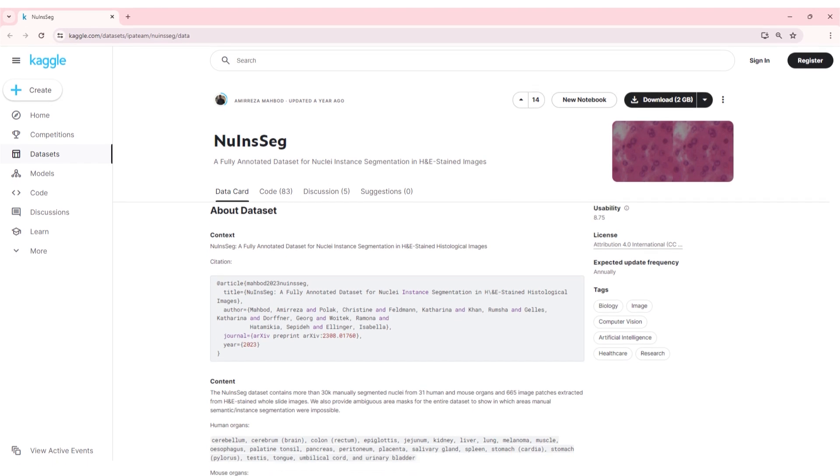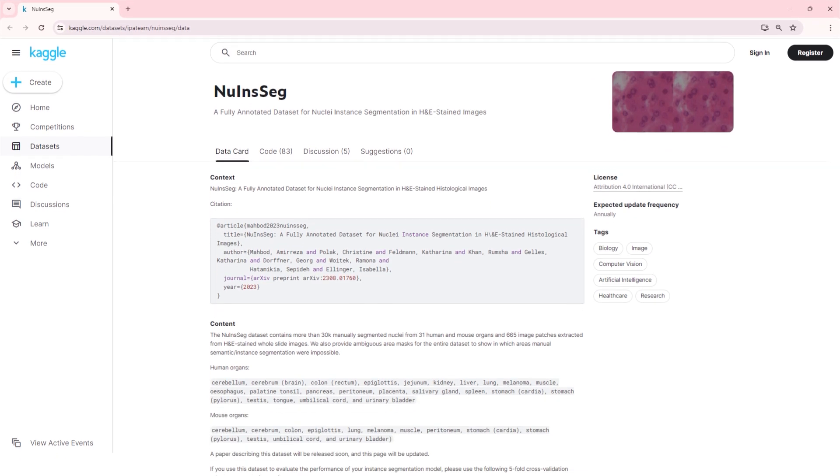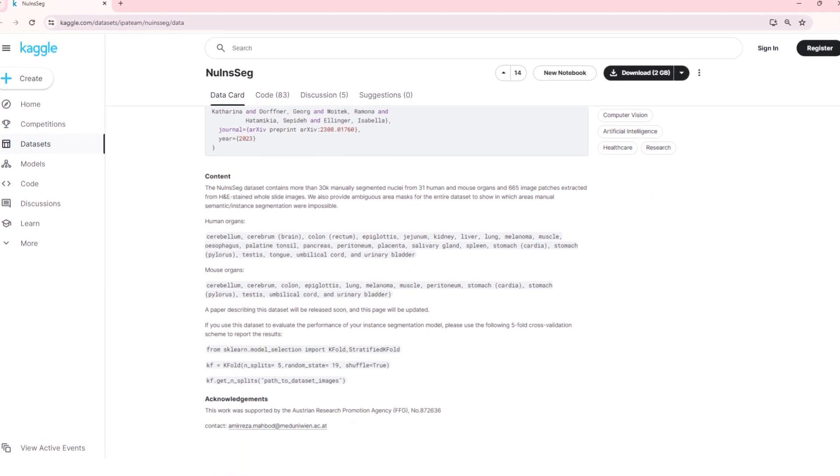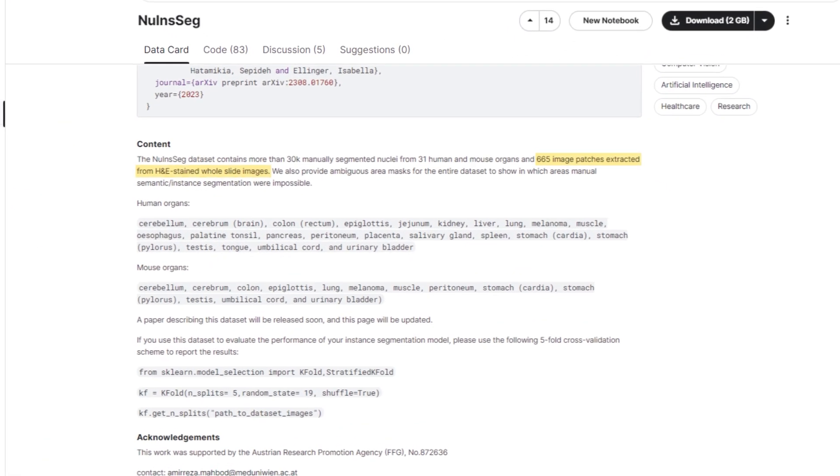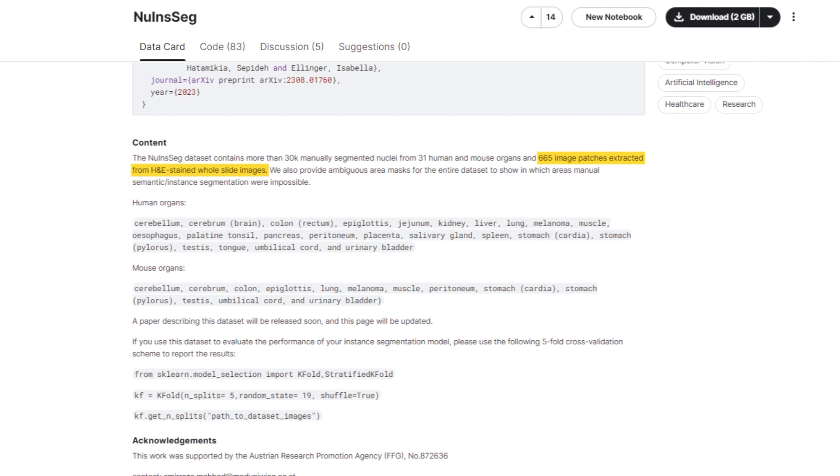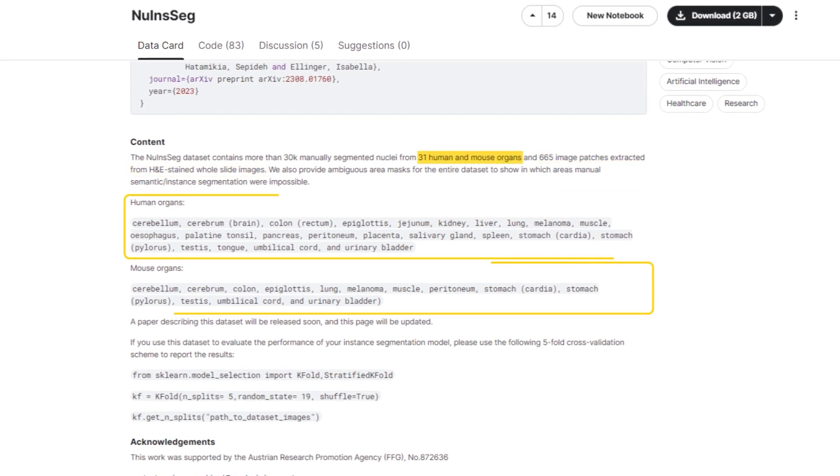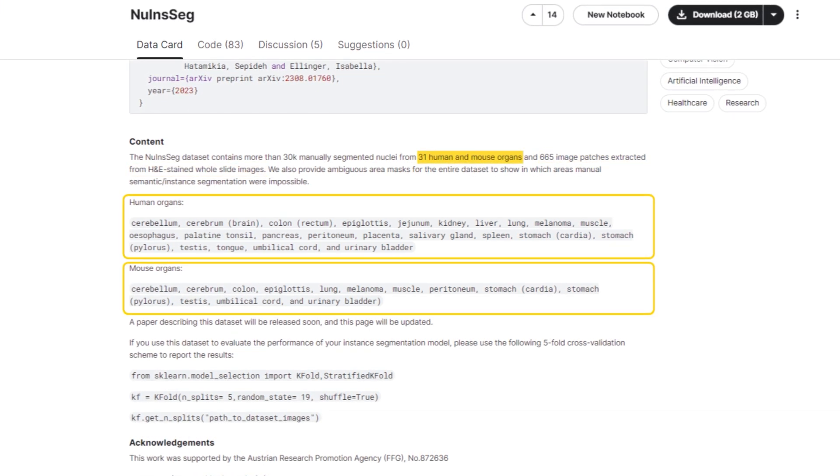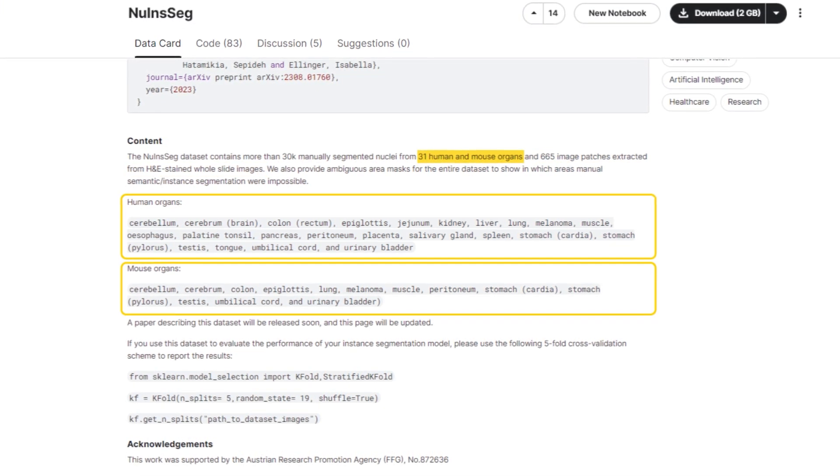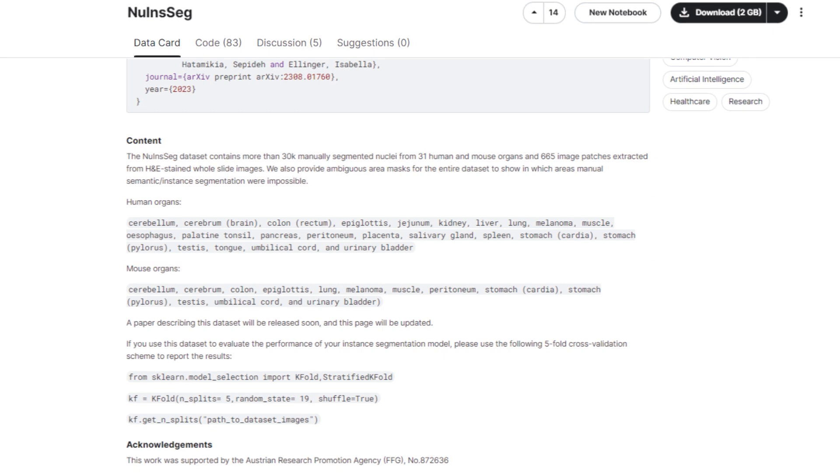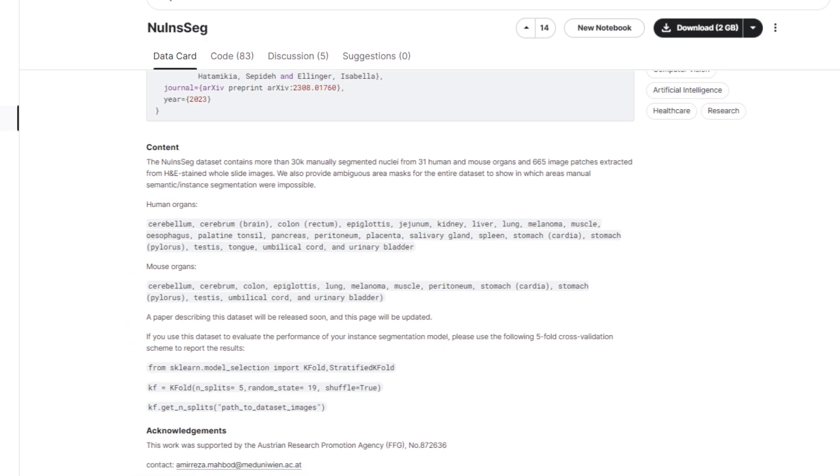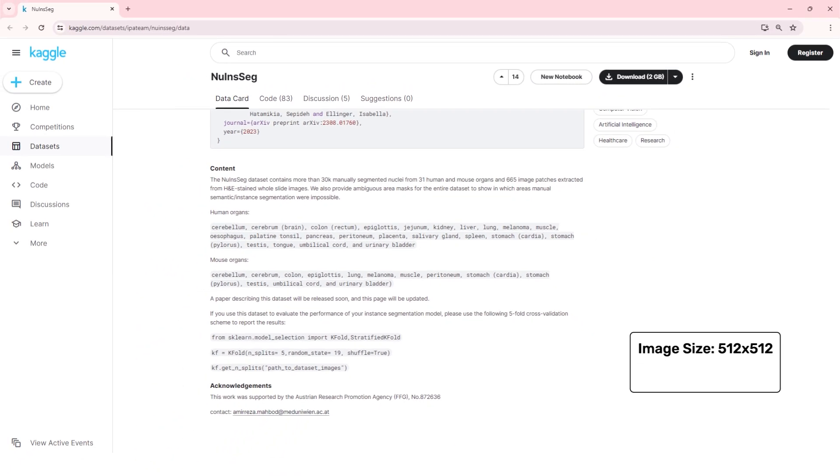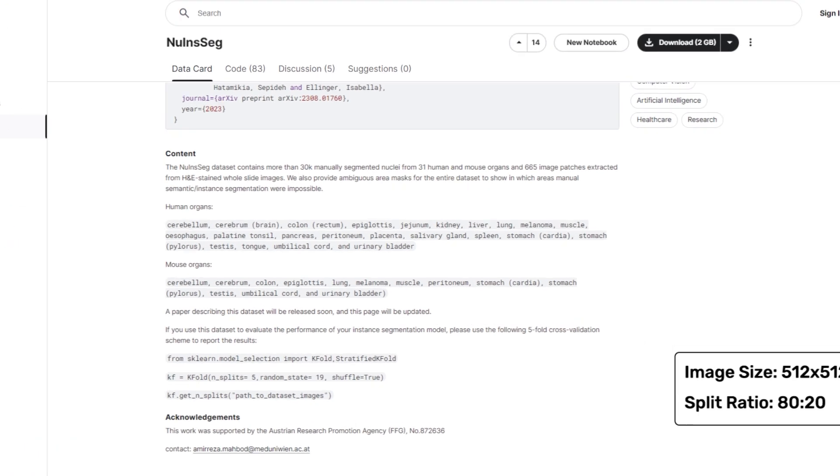We're going to be using the Nuclei Instance Segmentation Dataset, which consists of 665 image mask pairs over 31 human and mouse organ samples. The images are of size 512 x 512. We'll be splitting the dataset in 80 to 20 ratio in training and validation sets. Now, let's fine-tune and compare the models from YOLO V8 and YOLO V9.